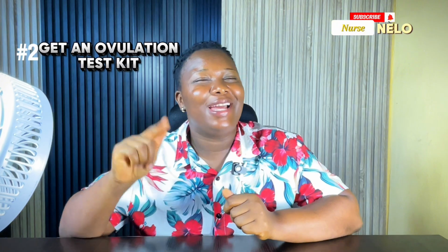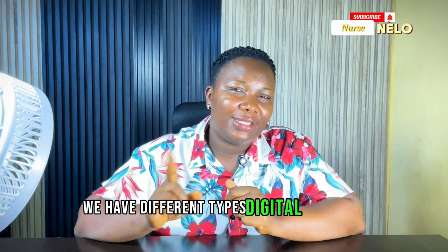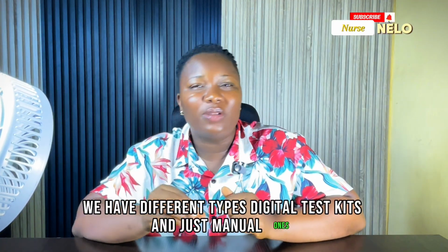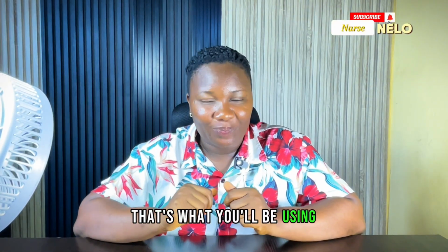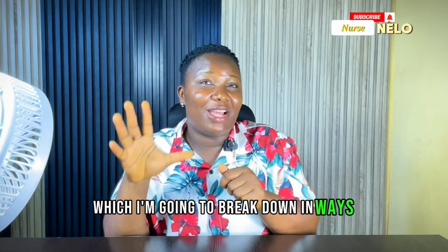Then secondly, you need to get an ovulation test kit. You have to get it. We have different types, digital test kits and just manual ones. Just go to a good pharmacy and ask for a good ovulation test kit. That's what you'll be using. The number 3 step is now to track properly, which I'm going to break down in ways that you will understand.